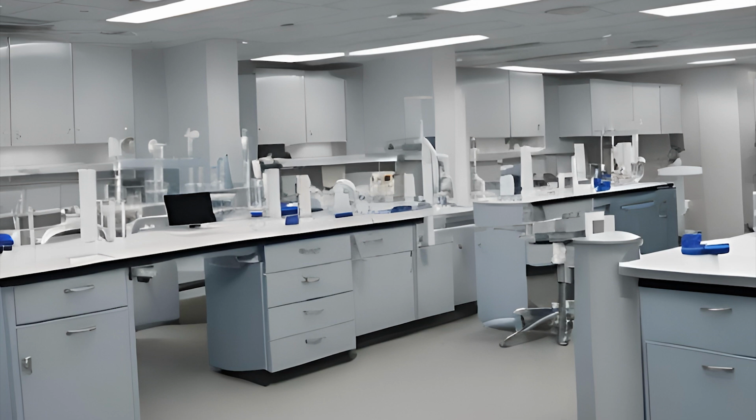If that sample is delayed, those organisms, potentially pathogenic in nature, can dry out and die and stop moving. And when you put it on the microscope, if they've died and they're not moving, you won't find them. So you could miss something that a person has as a pathogenic infection because of a delay in transport. Or improper transport conditions.